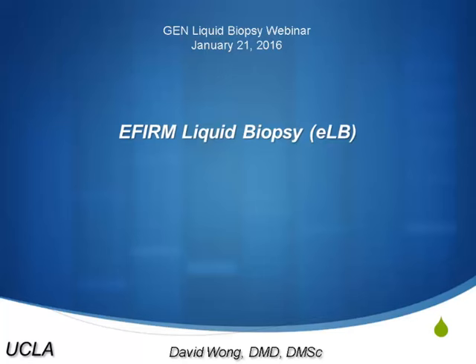Thank you for the opportunity to share with you today our research on this rapidly emerging landscape of liquid biopsy. What I'd like to do is bring to the field a non-PCR-based technology, an electrochemical-based platform that can detect circulating tumor DNA that could deliver the sensitivity and performance that fulfill the translational and clinical goals of liquid biopsy.